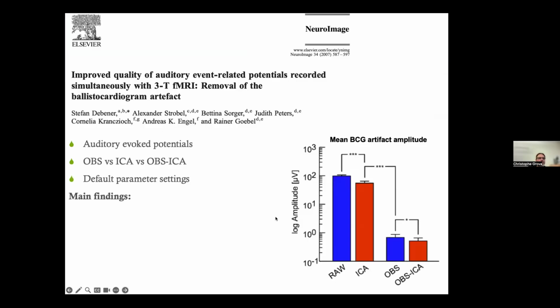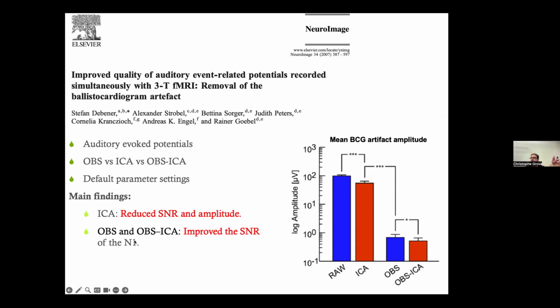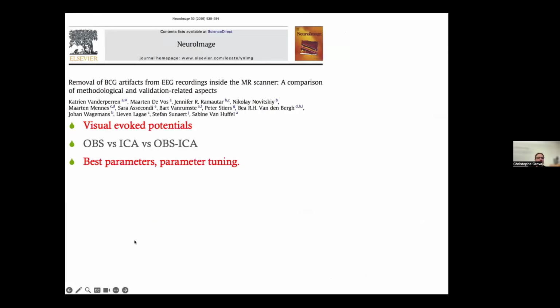This is a study that was done by Stefan Debener, who's considered as really an expert in the domain for applying EEG fMRI for cognition. And he compared different techniques. It was done using auditory evoked potentials, so it's looking at the amplitude of the evoked potentials in different conditions. He found out that applying ICA reduced the SNR and the amplitude. With OBS or OBS combined with ICA, you improve the SNR. They were looking for the N1, so the 100 millisecond response after an auditory potential.